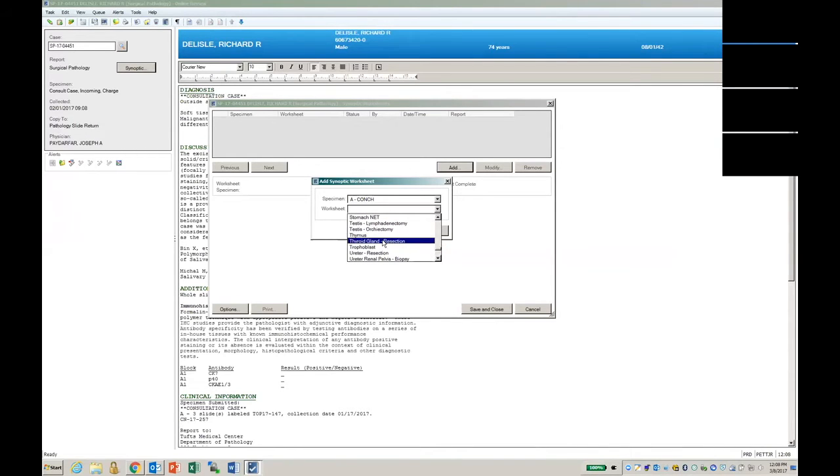Are these user defined, or does that come with the software? The names of the templates are derived from the CAP ECCs, so we don't change the names. Depending on how much customization you get into, you might make your own. But these are all out of the box from CAP. Is that what you mean, the names of these? Yes, thank you. They're named the same way as the CAP Cancer Protocol website. That's all tied together. So, thyroid gland resection.